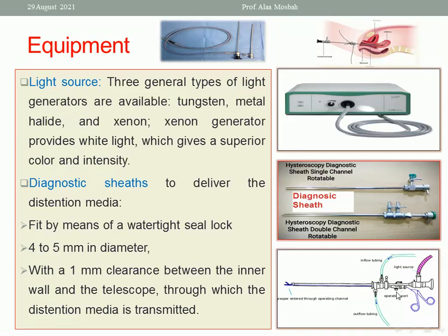So in this picture, you can see the sheath, the telescope, okay, and this is the flow, the irrigation media coming from here, and this is the outflow from here, and this is the light source, okay, connected.